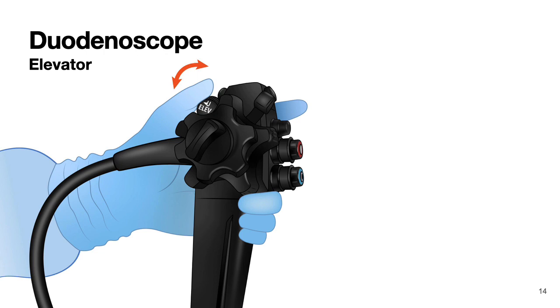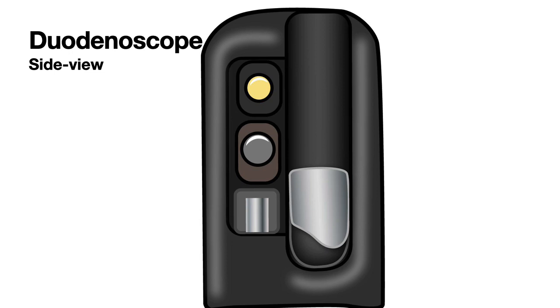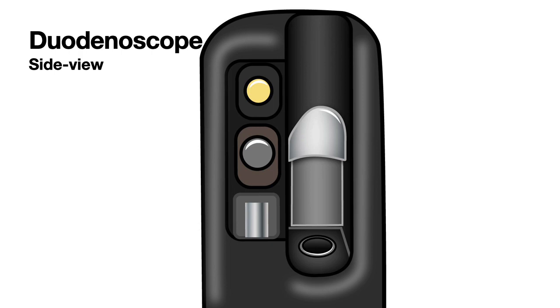So let us look at how the duodenoscope looks different from a regular endoscope or an EGD scope or a colonoscope. Here is a duodenoscope. This is a side viewing scope, so you can see the lens and the light coming on the side rather than at the end. It has an elevator that is now in the up position, and now it is in the down position. So let us look at how the elevator helps the endoscopist.